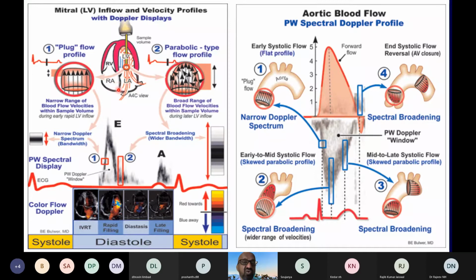Because this velocity is low, we need to use pulse wave Doppler, especially when you're looking at the diastolic function of the left ventricle. But in mitral stenosis, if we want to determine the gradient, because the velocity will be increased, because the blood has to pass through a narrow orifice. In mitral stenosis, the orifice is reduced. Normal value is 4 to 6 square centimeters. So if it becomes less than 2.5, and especially if it is 1 centimeter and less, where there is severe mitral stenosis, the velocity will be increased, and you need to use continuous wave Doppler.